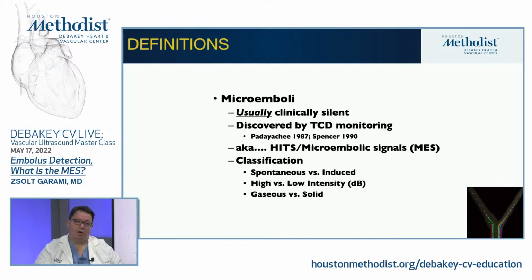When we monitor surgeries, we try to see if it occurs during the injection, and then we may call them more gaseous. When it occurs with a catheter moving and scraping the wall of the aorta or the carotids, then we call them solid. So we try to pair them with activities during the surgery, but no TCD machine today can tell us this is gas, this is solid. So we'll give you some examples of that in a moment.